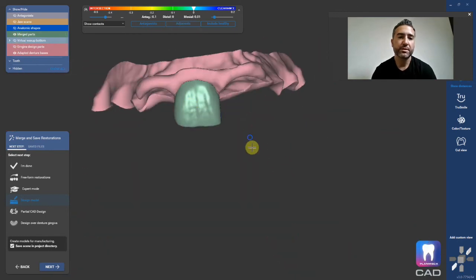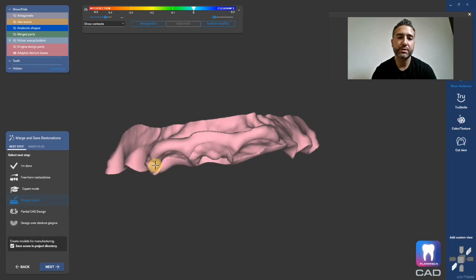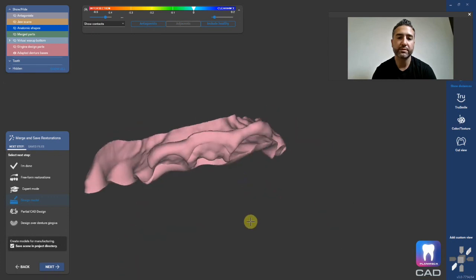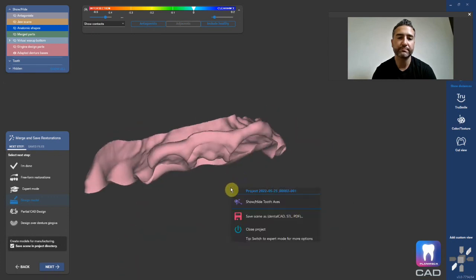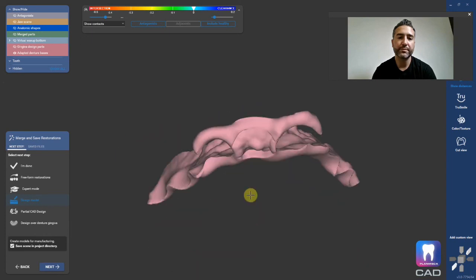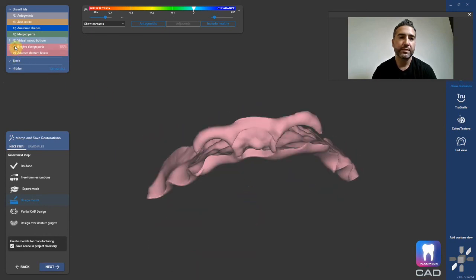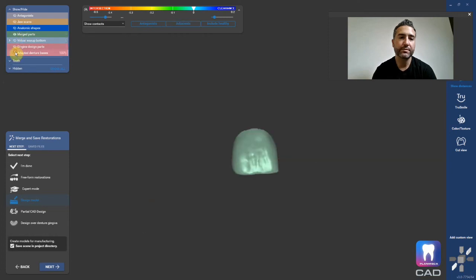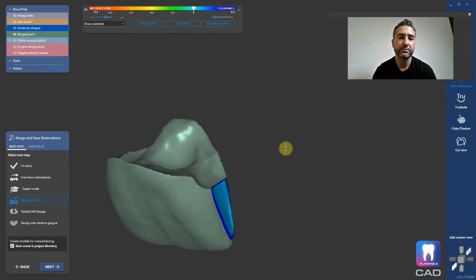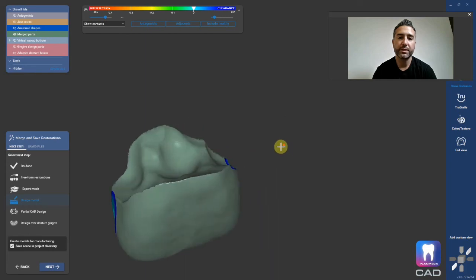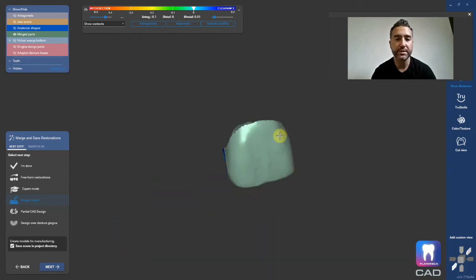And then you just print. Export this as an STL — right-click, save as STL. Print that out of Flexera base, and print the tooth out of Flexera smile. Bond them together in like five seconds and go to town.